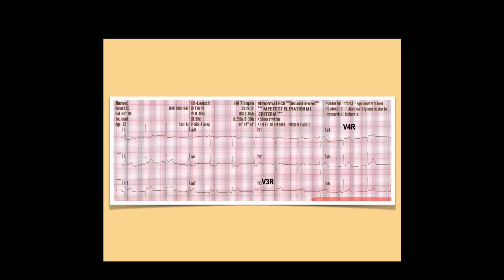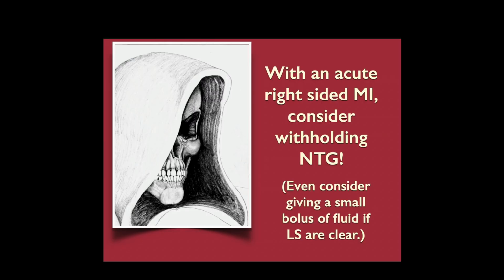And again, yes, we do have a right-sided. Okay? Oh, and here's the... Oh, they moved both over. Excuse me, I didn't see that. So V3R and V4, they moved 2 over. Okay? And this is another thing you can do.